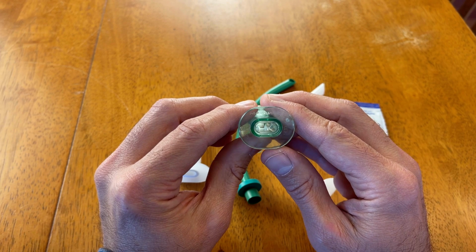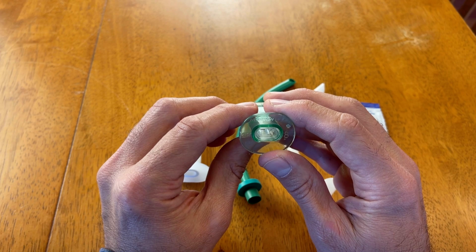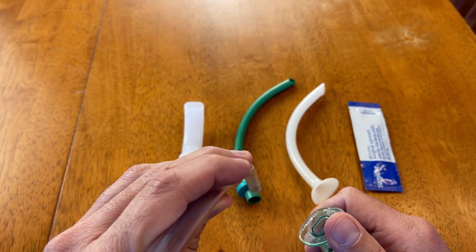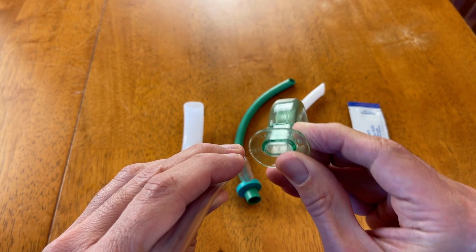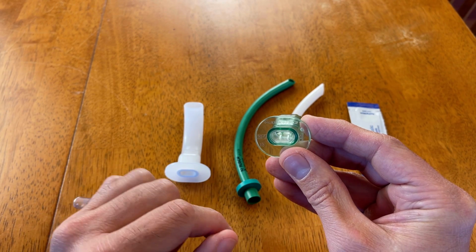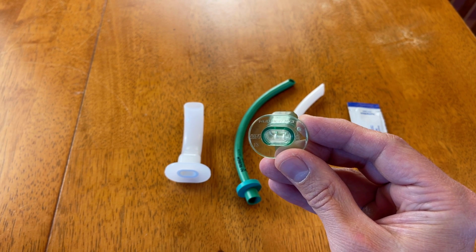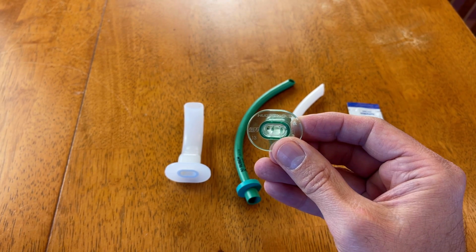But there is a second alternate technique which I really like, and that is using a tongue depressor or even a rigid suction catheter. I have one here, and I will use this to physically displace the tongue and the soft tissue, and now I can insert this straight on the patient without risk of causing any soft tissue injury. So whether you use a rigid suction catheter like I have here, or a tongue depressor, or possibly even a laryngoscope blade, you can apply this straight in without having to rotate it.